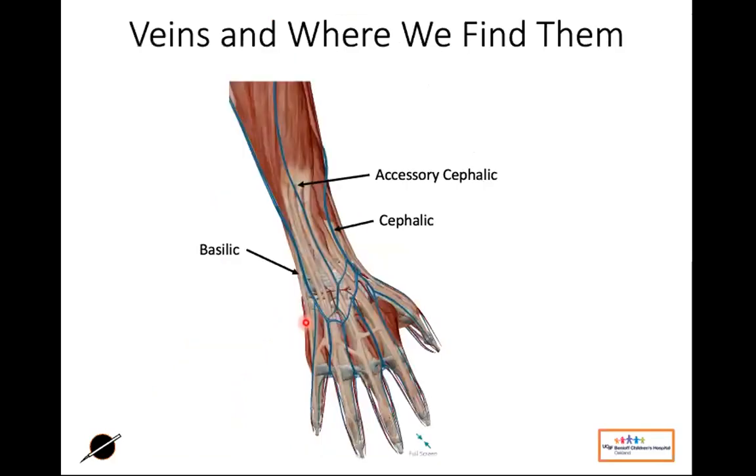Back of the hand, we've got the accessory cephalic, the basilic, and the cephalic. Cephalic is one of my favorites. It's one that's not often chosen, but it's really nice because it hasn't been chosen often in a traditional sense, with the ultrasound it makes it a good target.